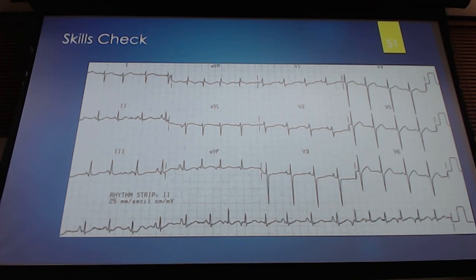Okay, so we have tachycardic, irregular and narrow. What would we say are our differentials for that type of tachycardia? So AFib, multifocal atrial tachycardia, and A flutter with a variable block. We don't have to think about all the rest of that stuff. We don't even think about it. That's not part of our differential for irregular narrow complex tachycardia.